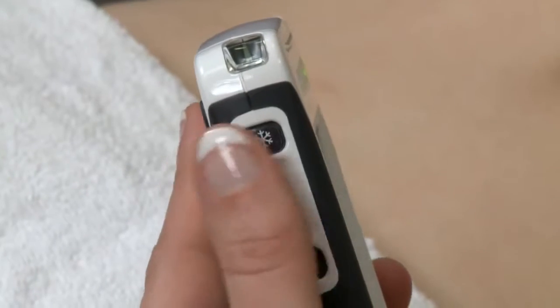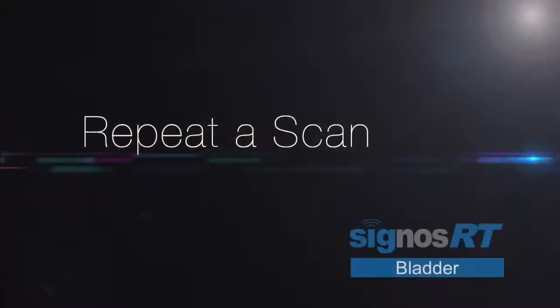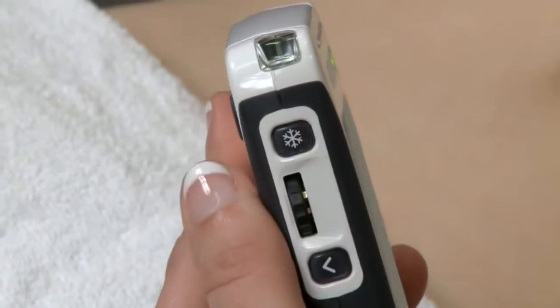When you have found the largest volume, stop scanning by pressing the freeze button. If you wish to repeat the scan, simply press the freeze button to begin scanning again.